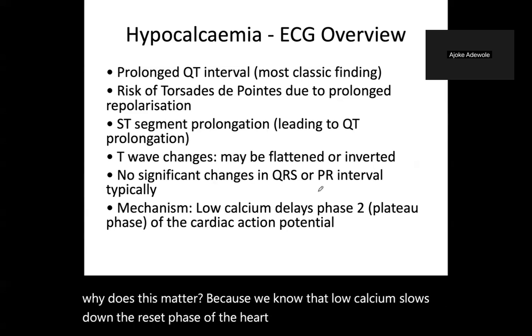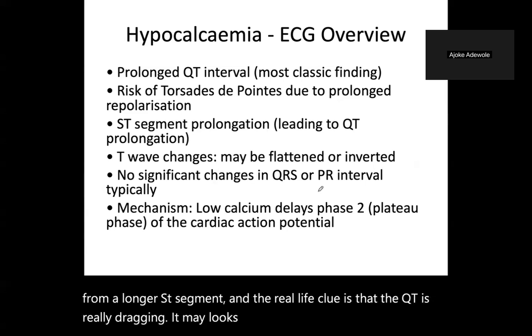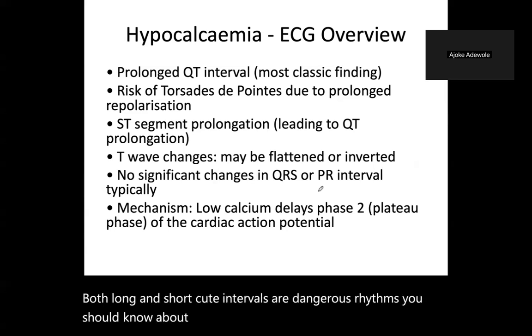The ECG shows a long QT from a longer ST segment. And the real life clue is that the QT is really dragging. It looks like the heartbeat is dragging. Both long and short QT intervals are dangerous rhythms. You should know about both, really.